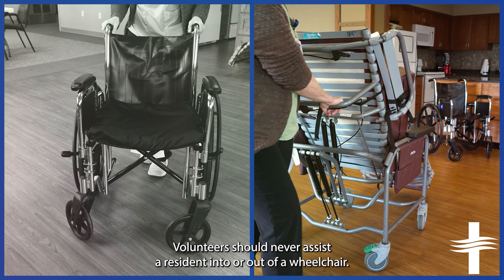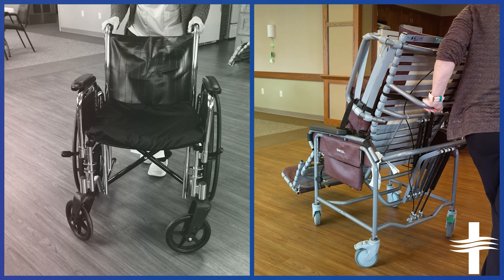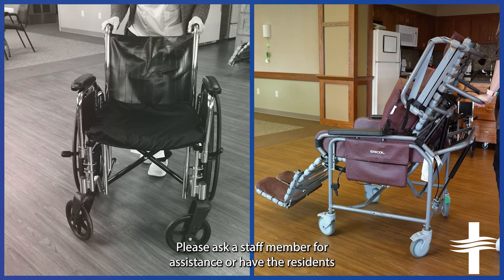Volunteers should never assist a resident into or out of a wheelchair. Please ask a staff member for assistance or have the resident push their call button in their room.